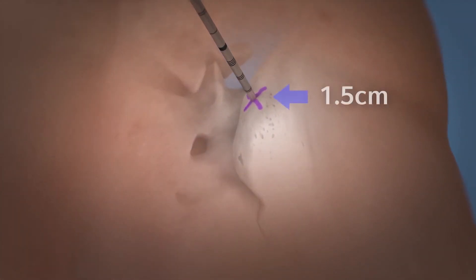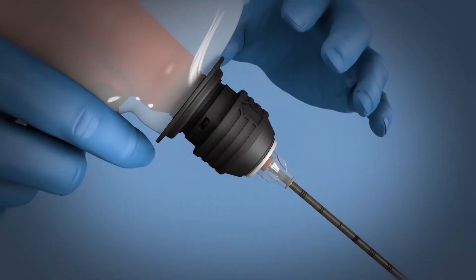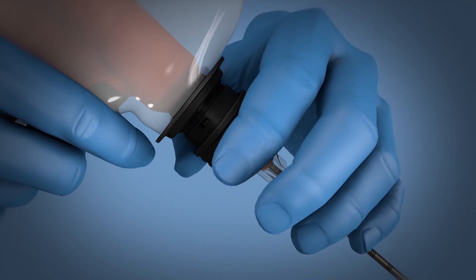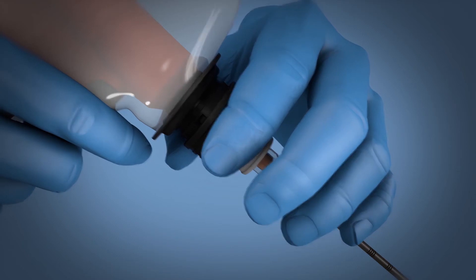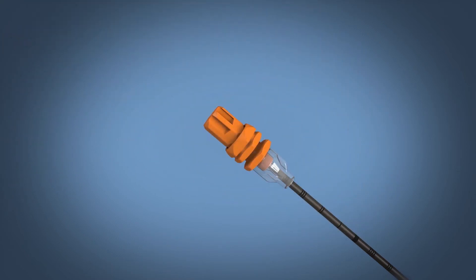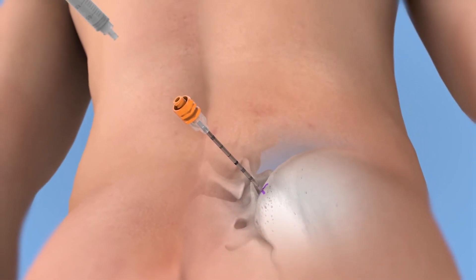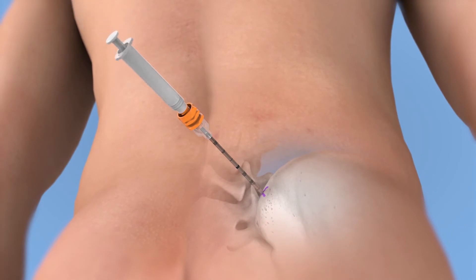Release the trigger when a change in resistance is felt or a depth of one to one-and-a-half centimeters is reached. Disconnect the driver from the needle by lifting up on the black collar on the connector and lifting the driver up and off the needle hub without dislodging the cannula. Gently twist and lift the stylet out of the cannula.